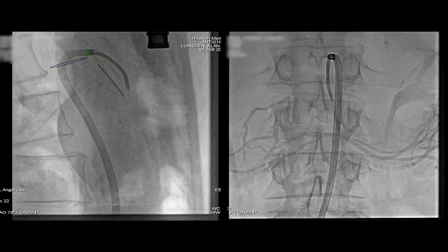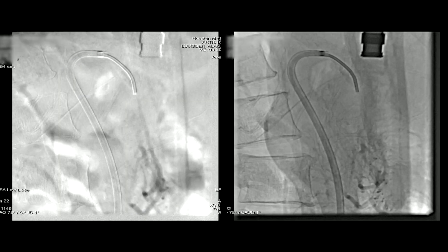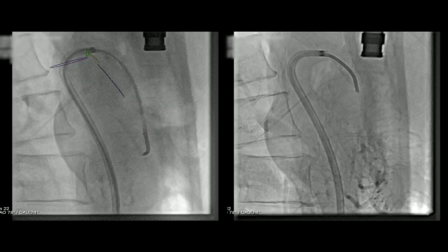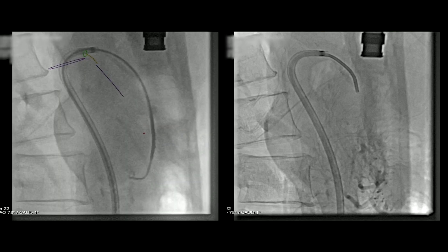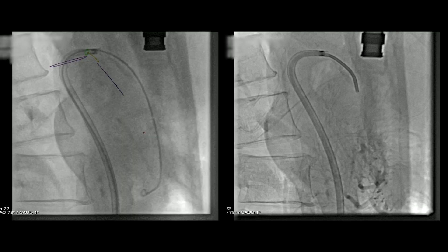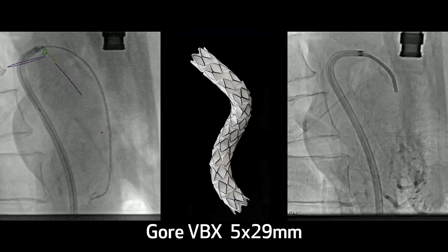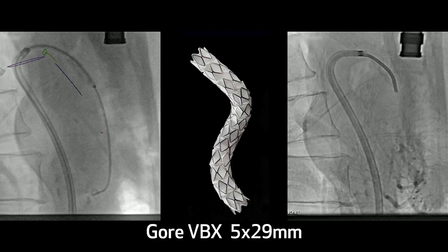So we then crossed the lesion with the catheter, injected it — tiny little superior mesenteric artery, only about 4mm in diameter. We confirmed this also with an AP view, and we're pretty confident we're in the lumen. We then placed the Rosen wire down into the distal branch of the superior mesenteric artery. We had sized this up — the plan was to use a 5mm by 29mm VBX.